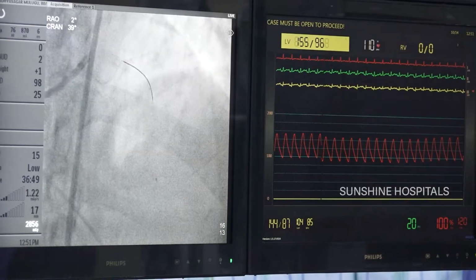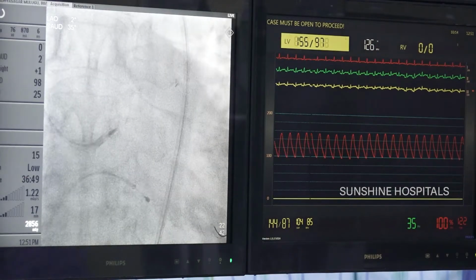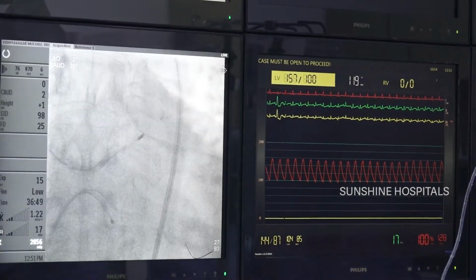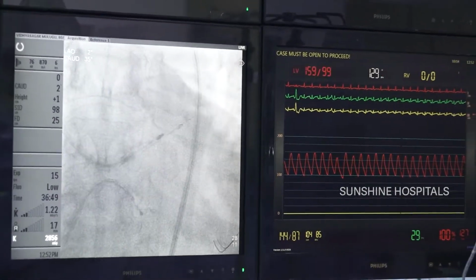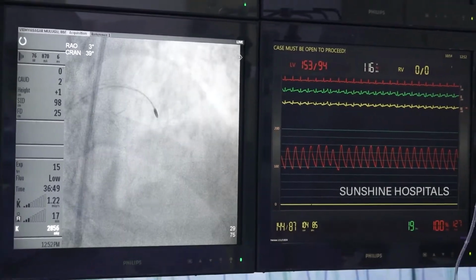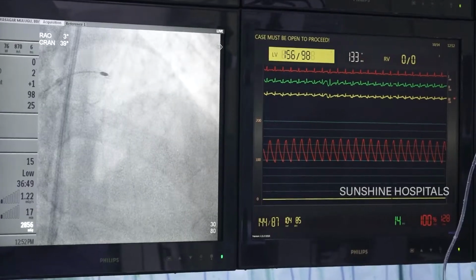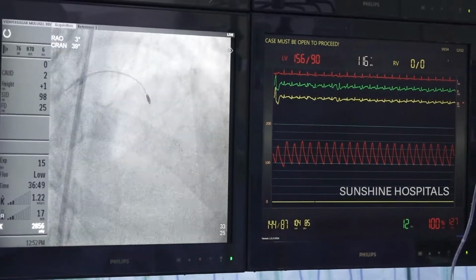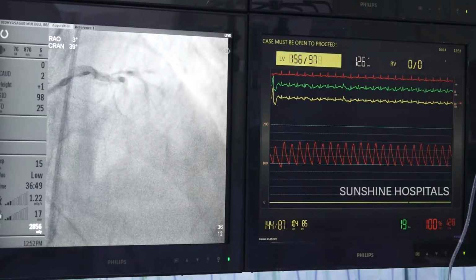Balloon trapping technique was used. Then go. You can see subsequently we did the rota. The rota we passed in the left main. We gave almost 12 runs of rota ablation using 160,000 revolutions per minute, 1.5 burr, RotaFloppy wire. So you see, even in every run there is a significant drop, almost 9 to 10,000 revolutions. Then we were giving small, like 10 seconds rotablations, multiple. Then finally we could cross that tough lesion.